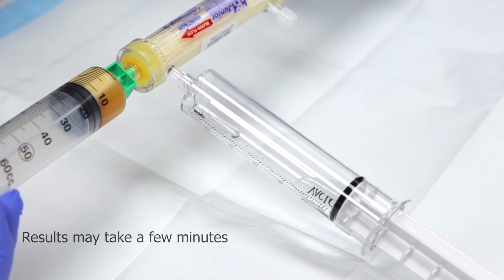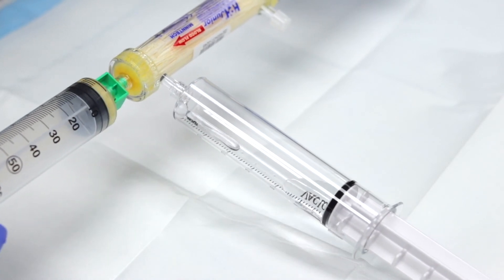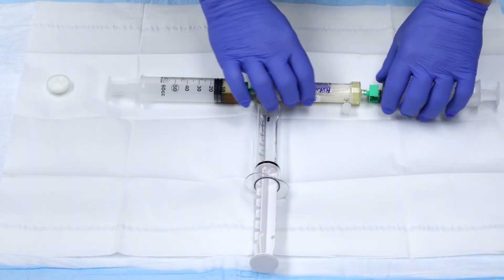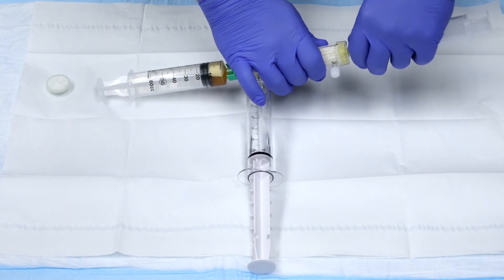You should see water dispensing into the VacLock syringe as it dehydrates. When completed, disconnect the empty 60ml syringe and the VacLock syringe.